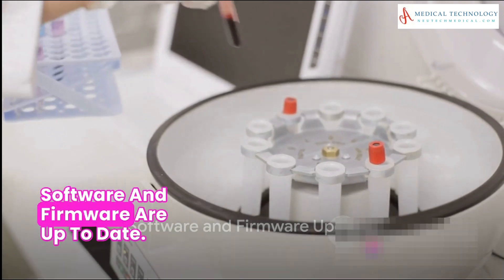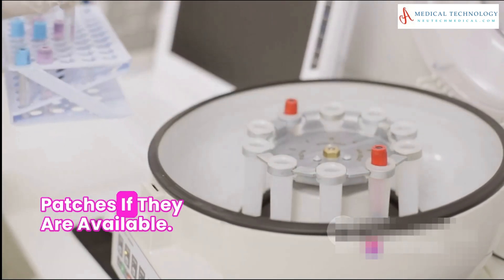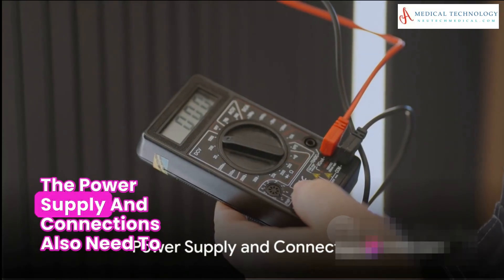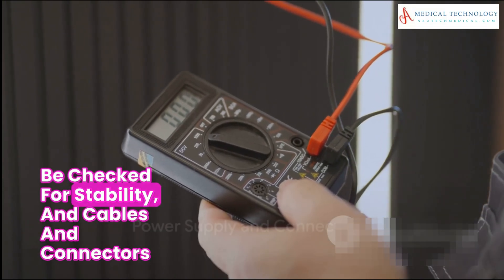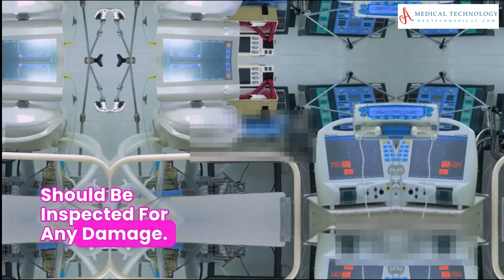Next, make sure the analyzer's software and firmware are up to date, and install any recommended updates or patches if they're available. The power supply and connections also need to be checked for stability, and cables and connectors should be inspected for any damage.